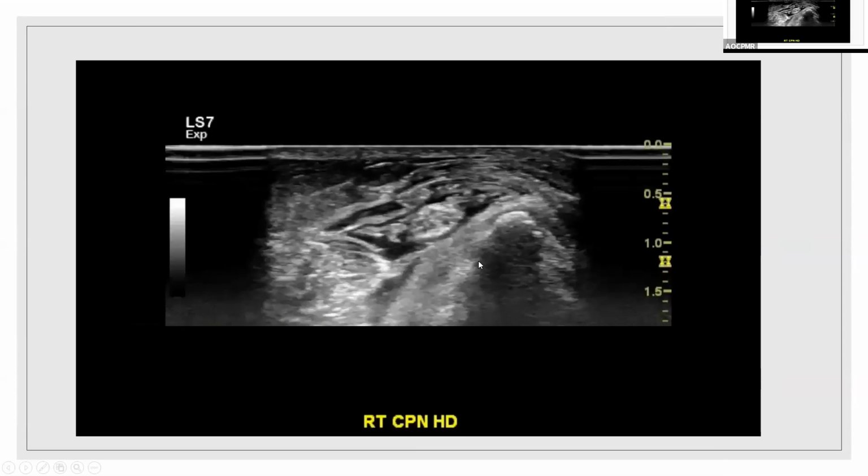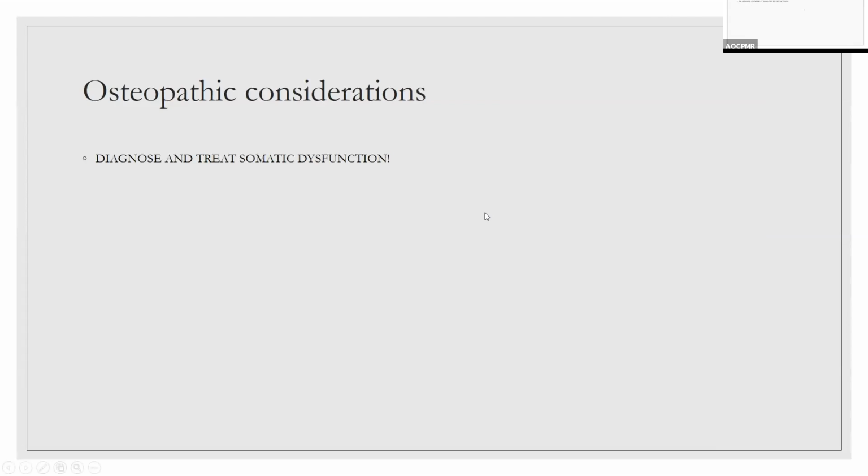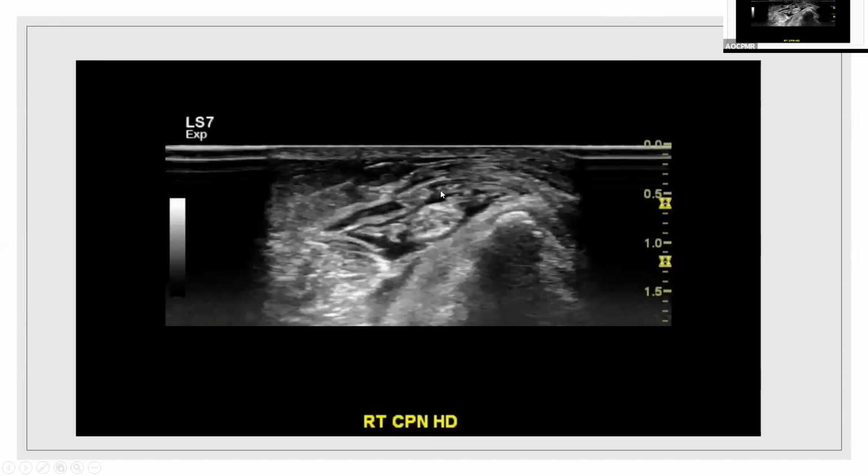So what I ended up doing was I did a hydrodissection. Hydrodissection is a procedure that you can do for nerves, hydro meaning water, dissection meaning to separate, where you go in with fluid, whether you're using saline, lidocaine, bupivacaine, dextrose, or some combination thereof. You go in with a needle and you basically insert fluid in all planes until you get what's called a donut sign, basically meaning you have fluid all around the nerve. You're basically separating all of this tissue off the nerve to let it breathe a little bit better, for example. It's kind of to decrease that compression around this fibular tunnel.